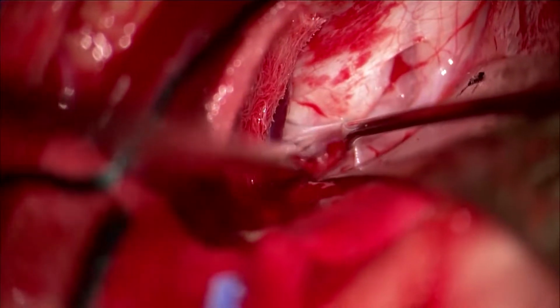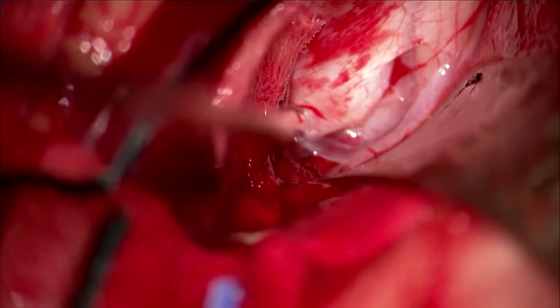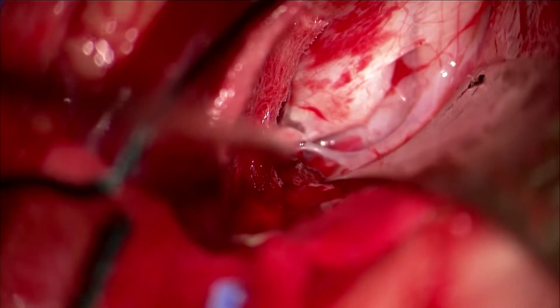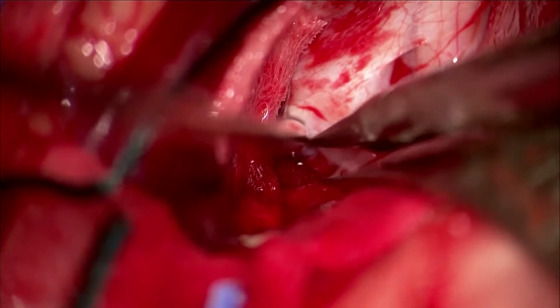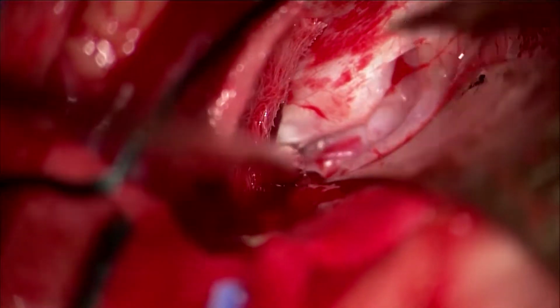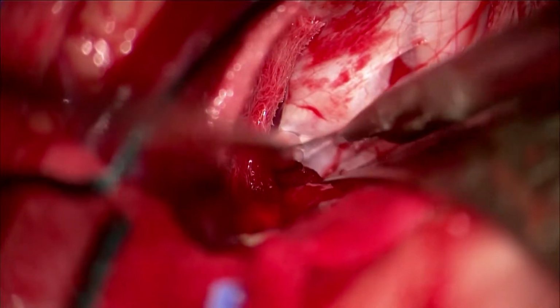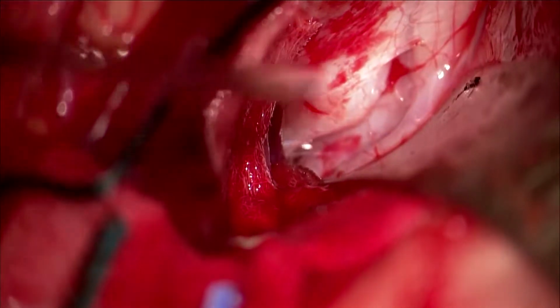Now a little bit deeper into the sylvian fissure, you can just start to see the patient's left optic nerve in the top right portion of the screen. And overlying where I'm cutting right now, deep to that, will be the left internal carotid artery as it enters into the skull, which can be seen right under my sucker there.